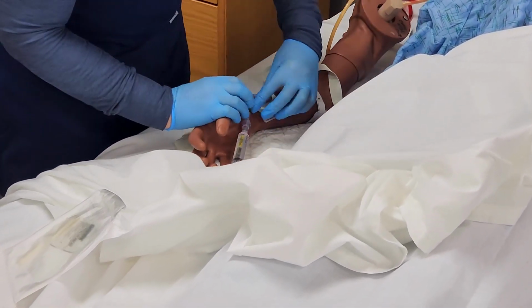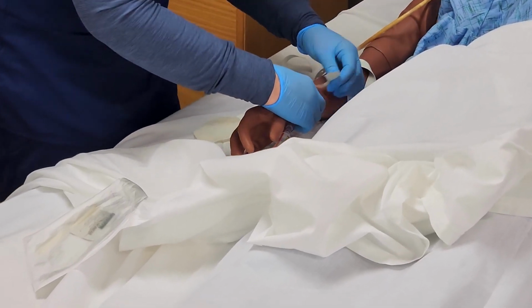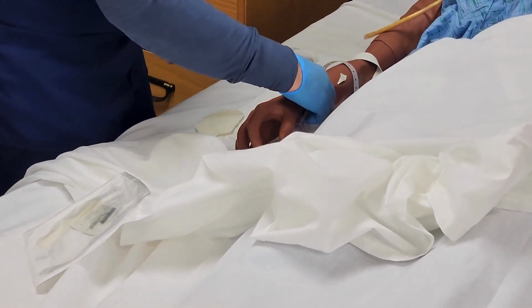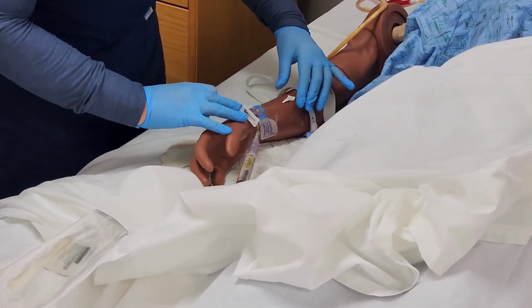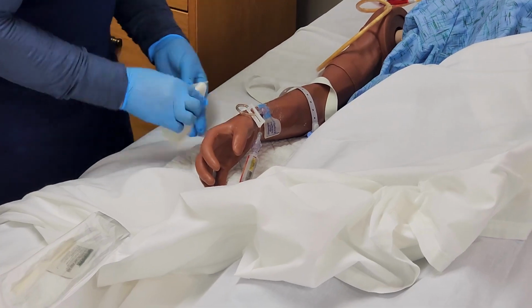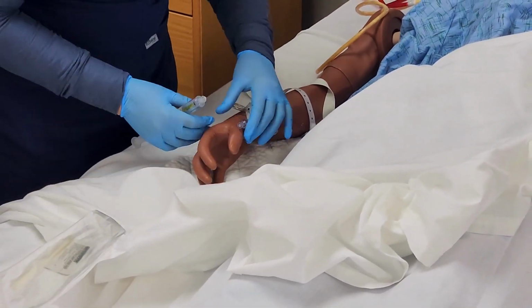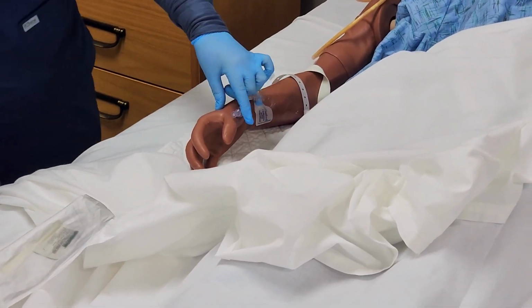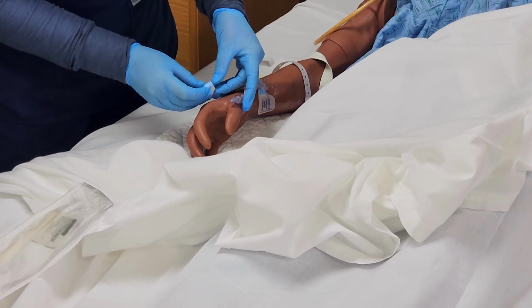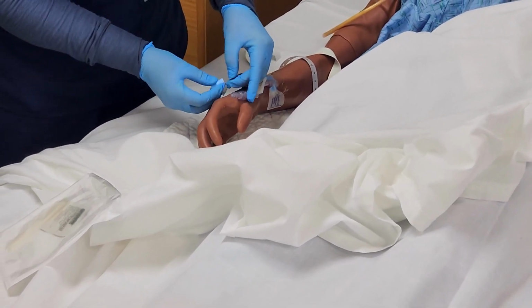Okay, I'm going to remove the outer sides here. All right, and then I'm going to remove my saline syringe, keeping that end sterile, and then I'm going to place my disinfectant cap on there.